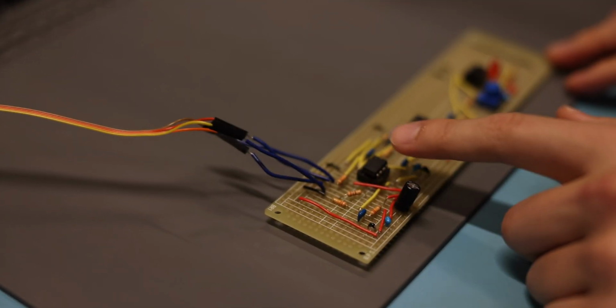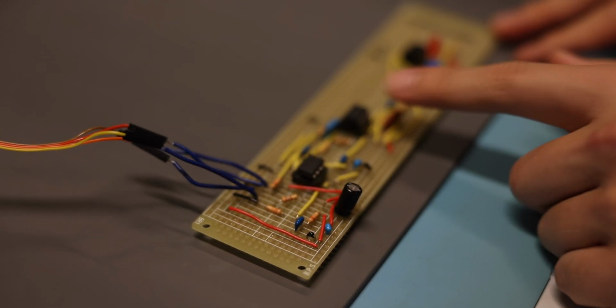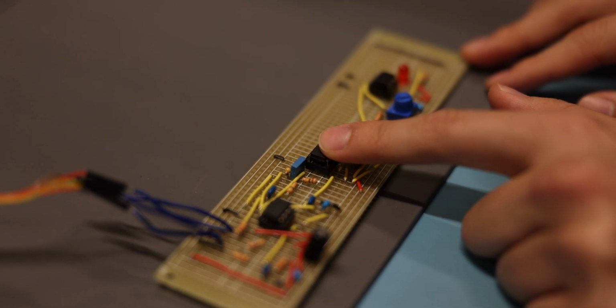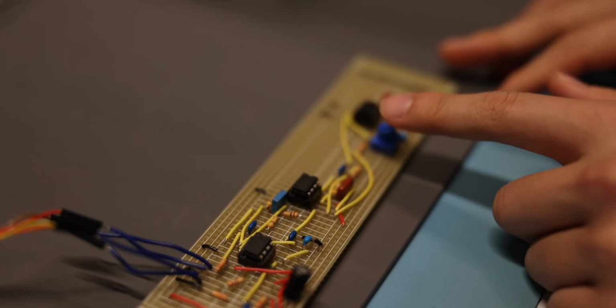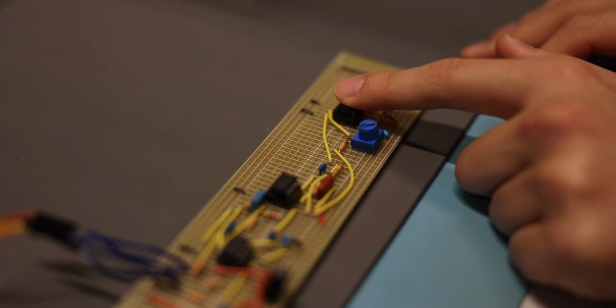Our circuit takes the signal from the sensor, passes it through a low-pass filter, and amplifies the signal, which removes high-frequency noise from the signal. Then it goes through a second-order bandpass filter and is once again amplified. This filter ensures we only have the desired signal before the signal is fed into a comparator to convert the signal into a digital 1 or 0.